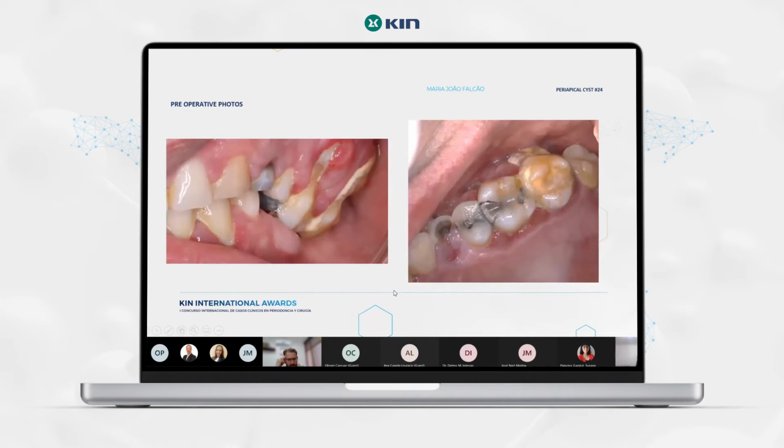So these are the intraoral pictures. You can see that we have a very red and purulent gum, a lot of plaque, a lot of tartar. We also had the fistula associated with the 24. None of these teeth are good to maintain, so the decision was to remove them. And that was what we did.